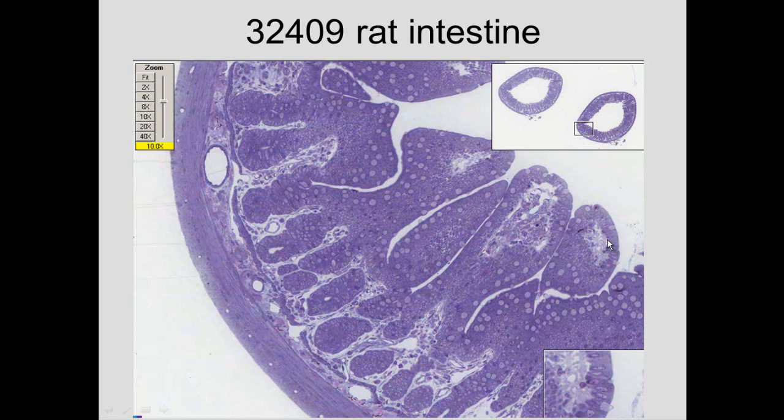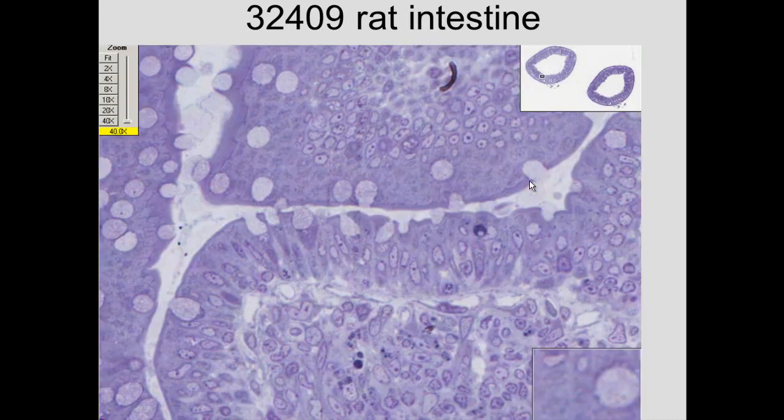intestinal absorptive cell, and here we can see the same thing. These are intestinal absorptive cells in through there with connective tissue down below. This darker tissue right in through there is smooth muscle, and this is smooth muscle there. Large blood vessels in through there, connective tissue in through here, and intestinal absorptive cells lining the lumen. A higher magnification shows you the brush border of these intestinal cells, and you will see the goblet cells discharging their contents in the lumen. So these are intestinal absorptive cells, these are goblet cells.